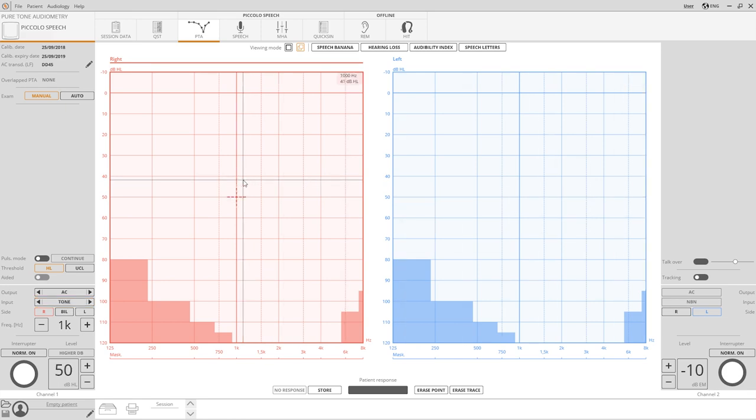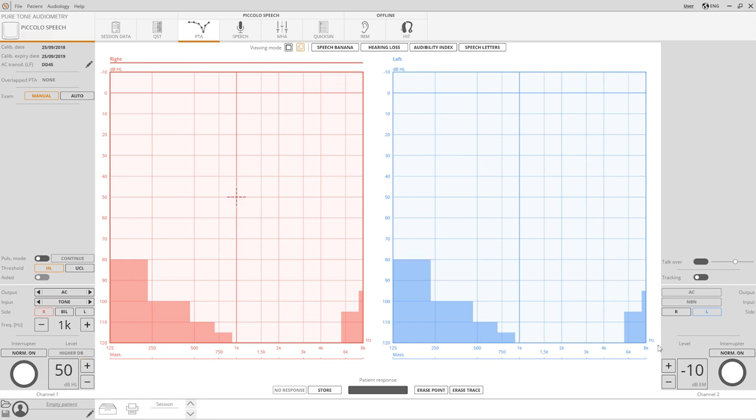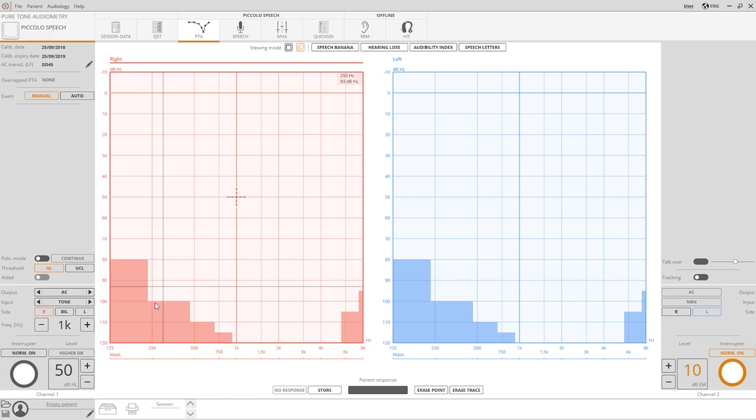Intensity levels can be modified by rotating the mouse knob or by clicking on the dedicated buttons. Increasing the masking intensity from minus 10 decibels will automatically turn the channel on. A safety lock prevents undesired stimulations above 100 decibels HL.